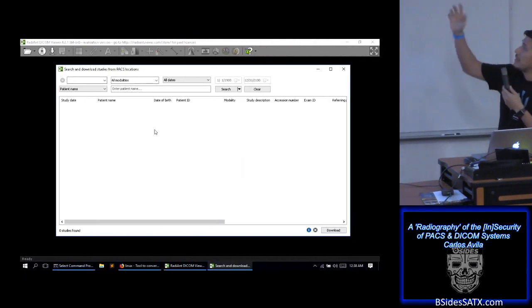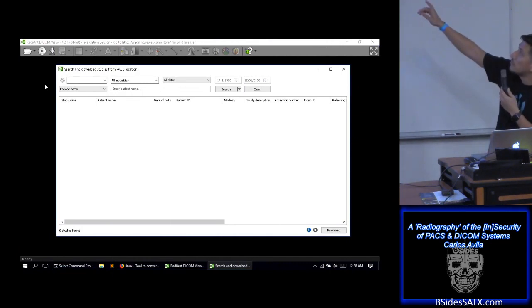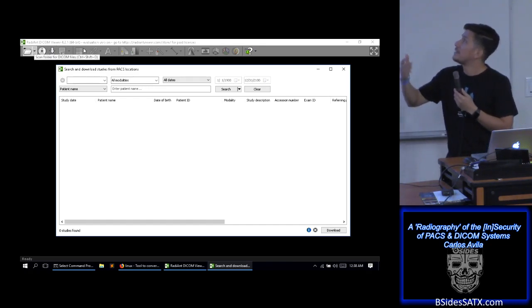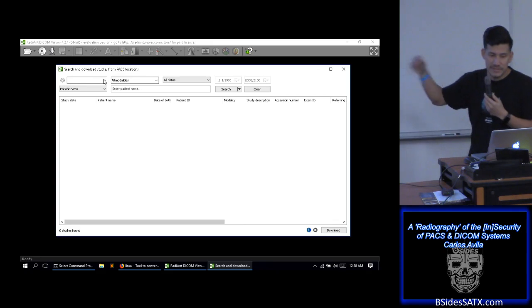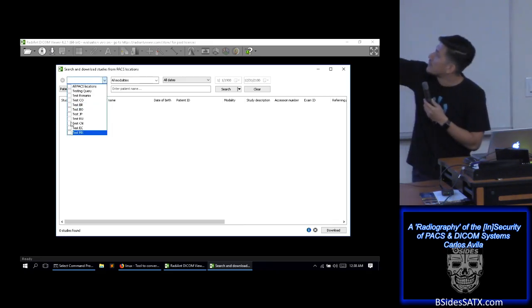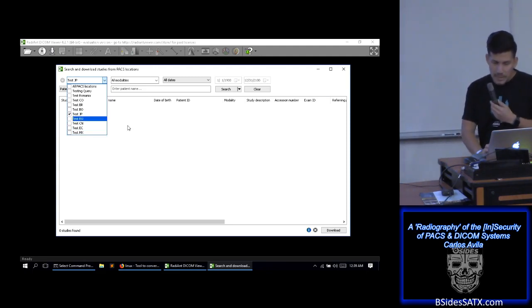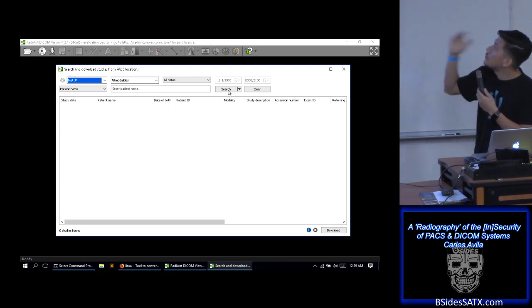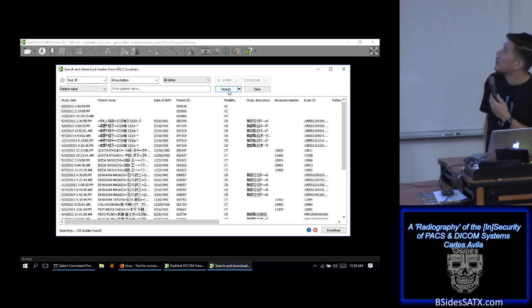As you can see in this video, it's a DICOM tool called Radiant Viewer. You download it, it's free, and you can configure the IP address and port. The default port of the DICOM services is 104. In this case, it's a test on a server exposed on internet in Japan. An attacker using a DICOM tool could extract this type of information on a server without any security.